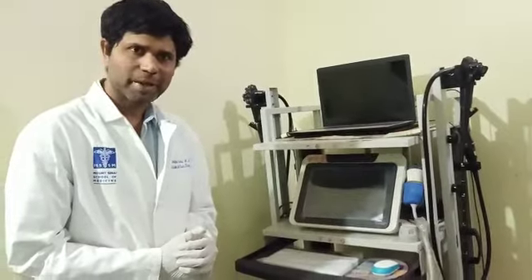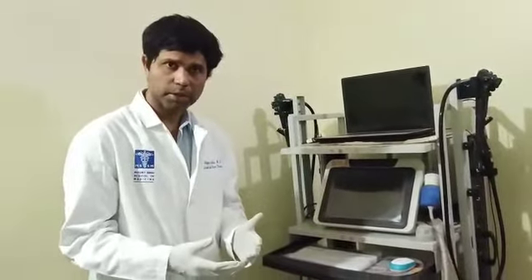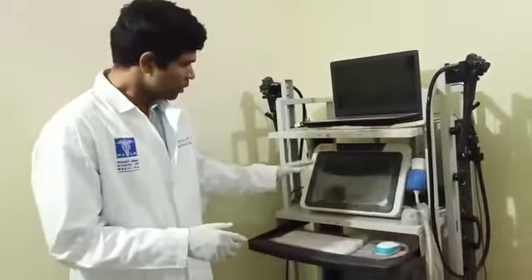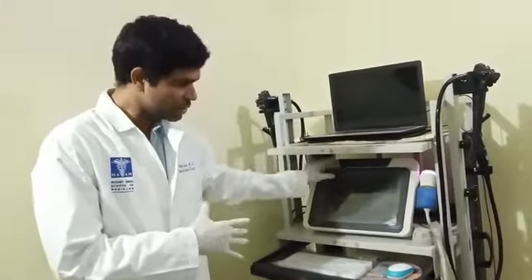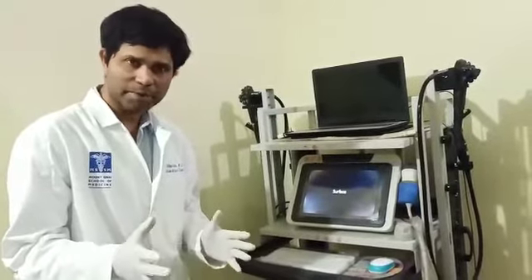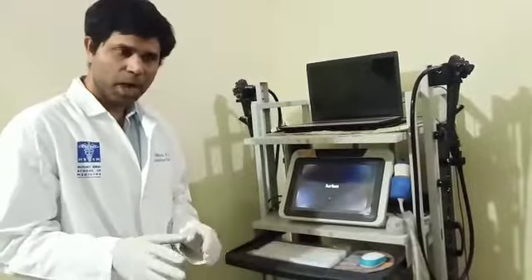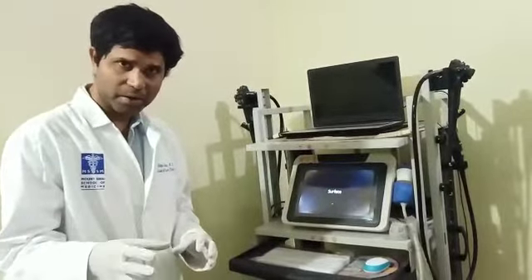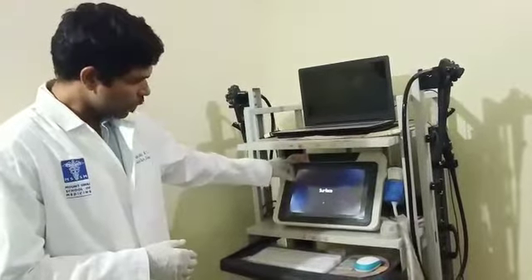Hello friends, I am Dr. Rada Krishna, a liver specialist and transplant hepatologist. Today we're going to discuss liver scan. Here we have a device called FibroTouch, which is a transient elastography machine. This machine estimates how our liver is — whether the liver is healthy, scarred, or whether it has developed cirrhosis.